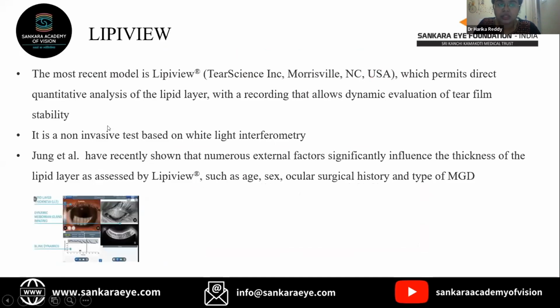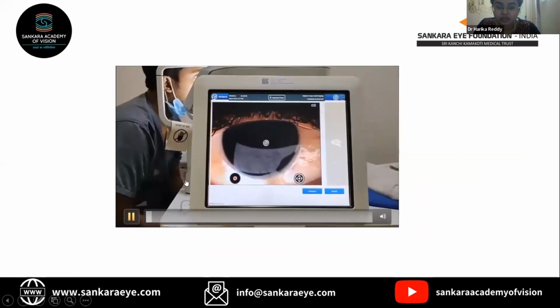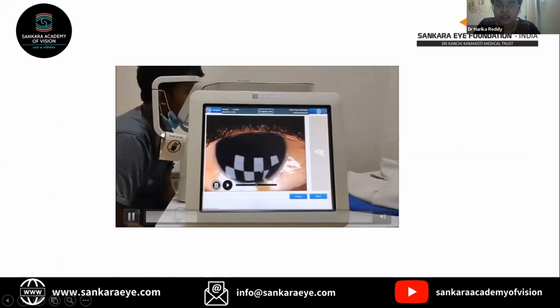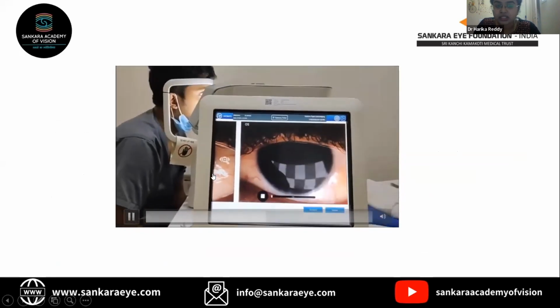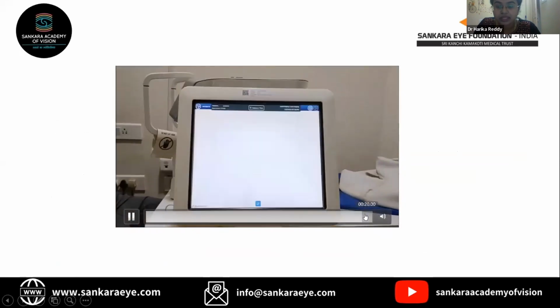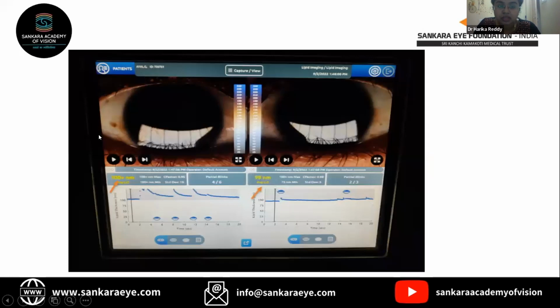Next, LipiView, a non-invasive test based on white light interferometry. I tried to do a LipiView for a patient. In case of measuring the lipid layer thickness, we put the chin rest nearer to the machine, and for meibography, away from the machine. Each eye we test for 20 seconds. And the final result after interpretation we get looks like this. This is a LipiView of a normal patient showing 100 and 99.